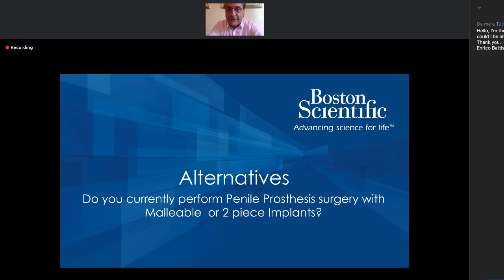Thank you very much for that. Russell, if you give me just 30 seconds, I would add to the explanation of Gabriele that probably in the setting of the homosexual patient, in my opinion, the infrapubic approach is better than the penoscrotal approach, because of the morphological aspect of the penis when you activate the prosthesis. My practice now is 50-50. I started to do it with Gabriele, and I enjoy the infrapubic technique a lot.